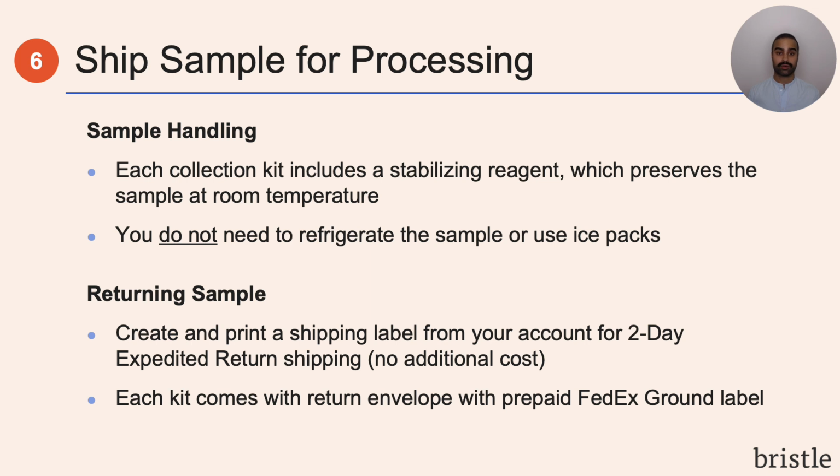The next step after registering the sample is to send it back to the lab for processing. Each collection tube has a clear liquid stabilization buffer that's already in it, and this helps preserve the sample during transit. So there's no need for refrigeration or using any ice packs. The sample will stay stable and preserved while it's in transit back to the lab.